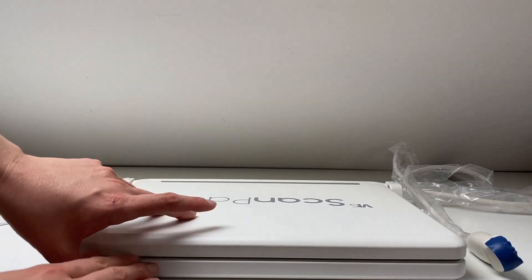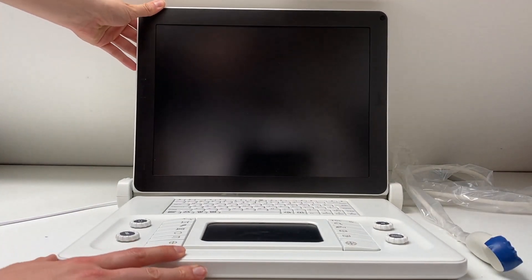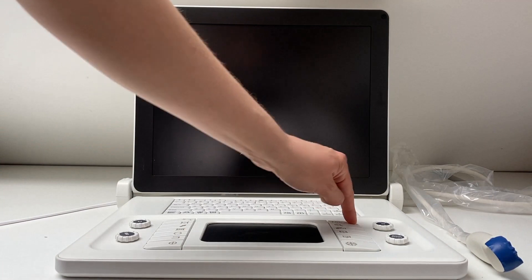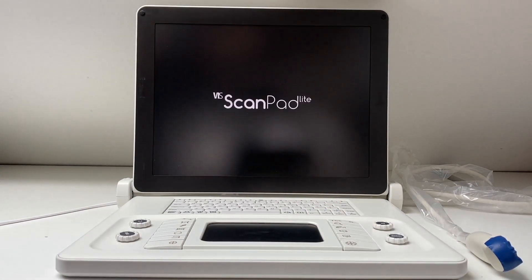To turn your scan pad on, simply open it up and locate the power button, which is to the right of the TGC. Press and hold and your machine will boot up.